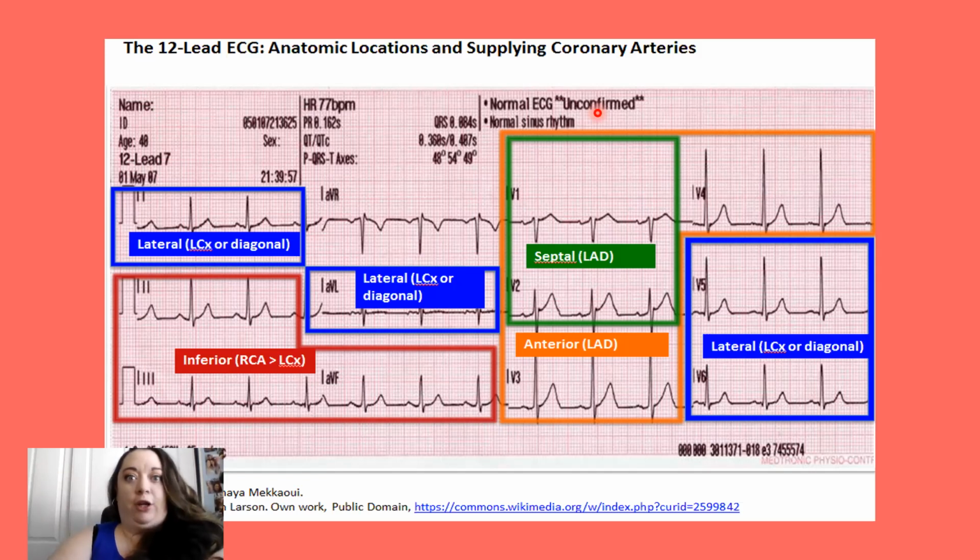It's not accurate all the time, right? So I actually have to have this physically signed off by a physician within like 5 minutes of getting this EKG done. So it's kind of nice because it's not our call to make that determination. All you have to do is get the EKG done and hand it off to a physician to make the call. My job though is making sure that I know what type of patient a 12 lead would be appropriate for. Anybody experiencing chest pain, obviously, and I'm going to get this done.